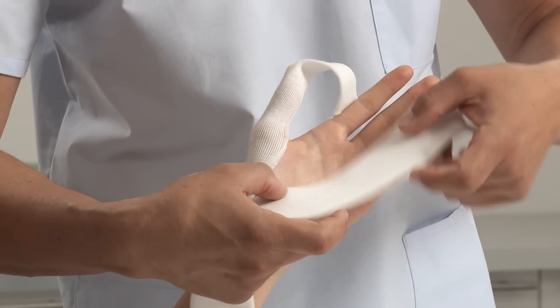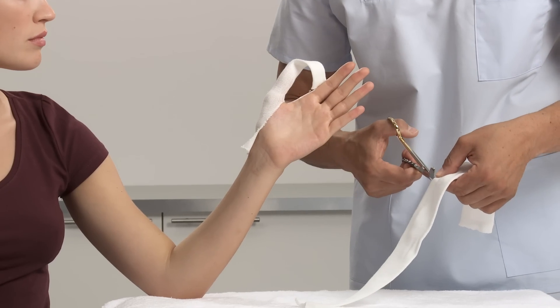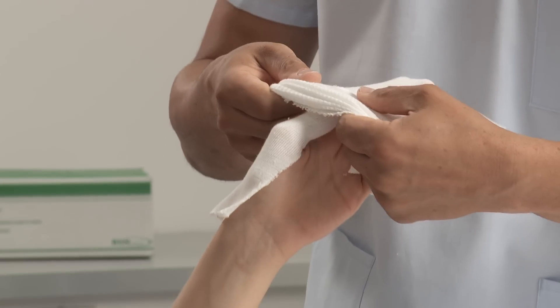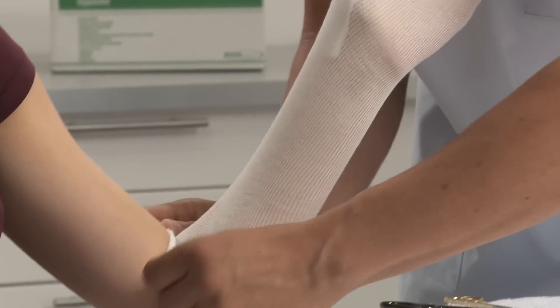Cut a hole into the arm stockinette at thumb height and roll it up before applying onto the limb to prevent sliding pressure during application. Roll off over the arm and smooth down.